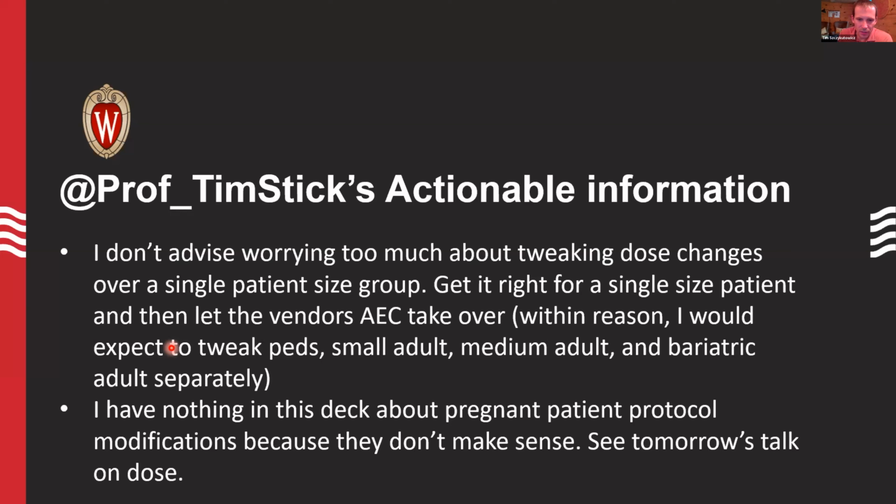I will say I have nothing in the stack about pregnant patient protocol modifications, because they don't make sense to me. I listened to a little bit of the previous talk, and you hear a lot of comments about making sure we're imaging pregnant patients with low dose. But then you also don't want to double dose them, right?